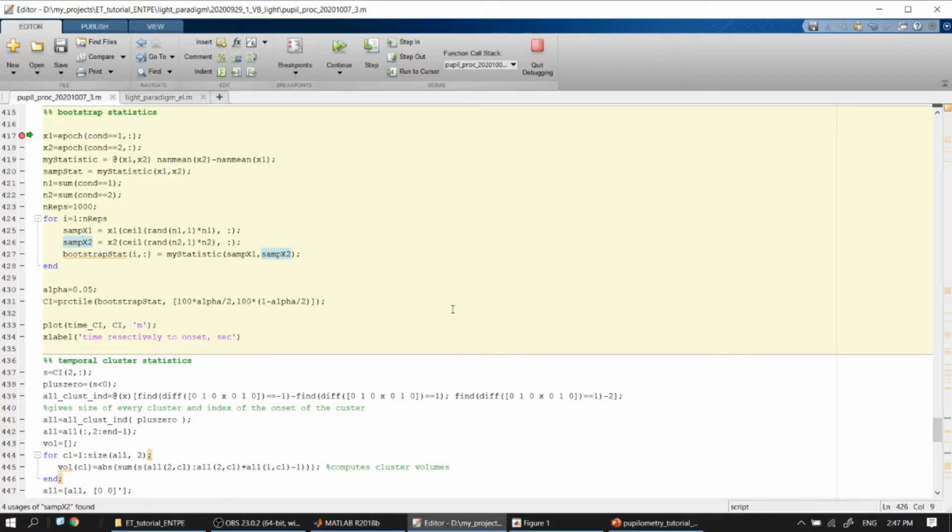And we take the threshold of 5% of the distribution.